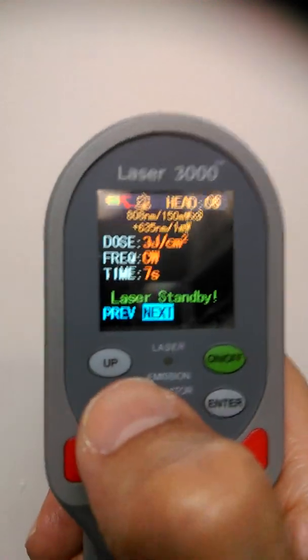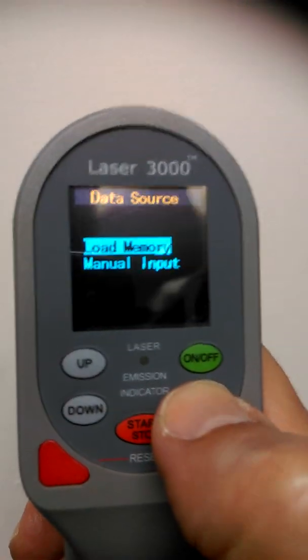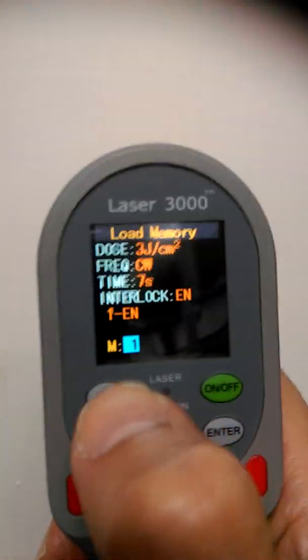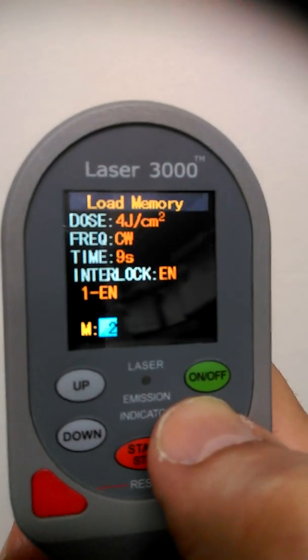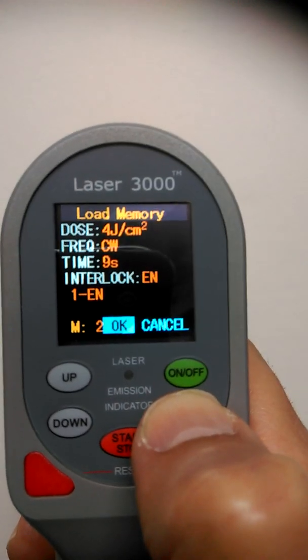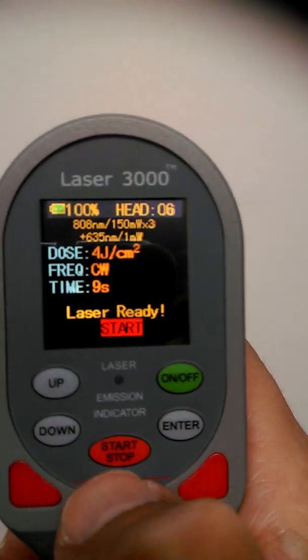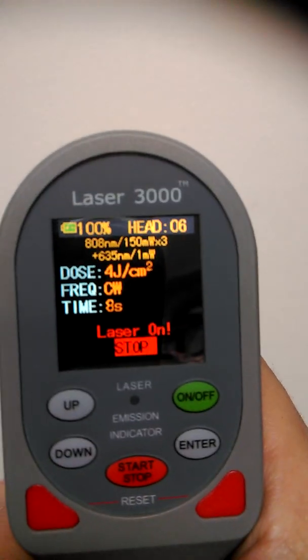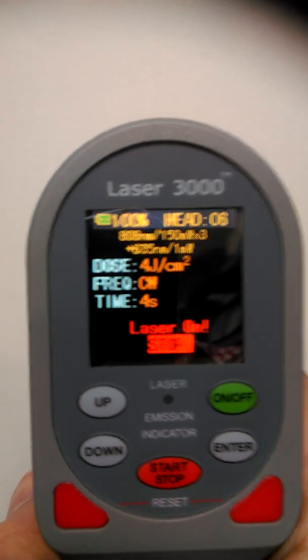If you want to increase it to four joules, press down to go to the previous screen — load memory. Four joules indoors will be M2. You'll see four joules, nine seconds, and EN meaning the interlock is enabled. Press enter, press enter again, next, glasses are on and off we go. The unit's counting down as it delivers the four joules.